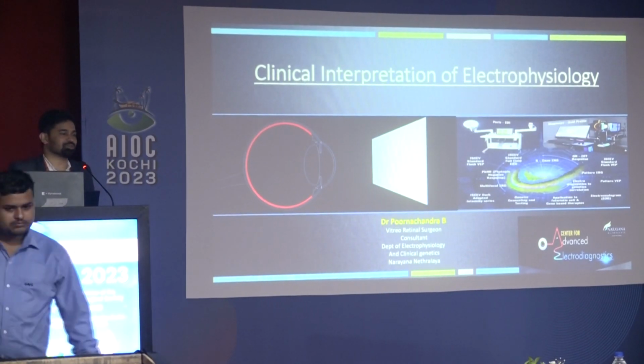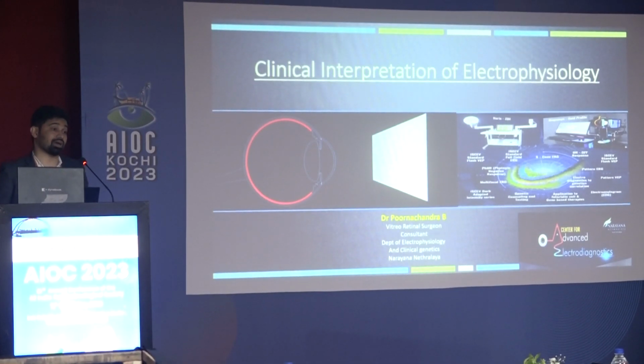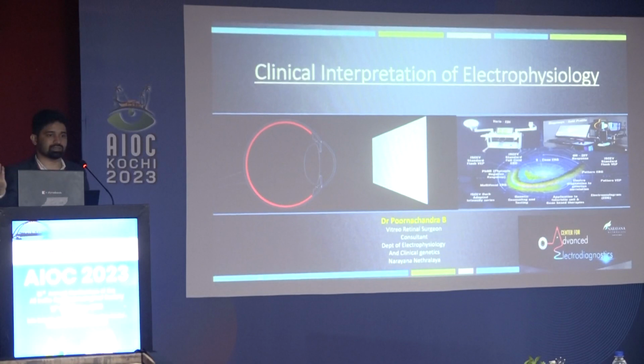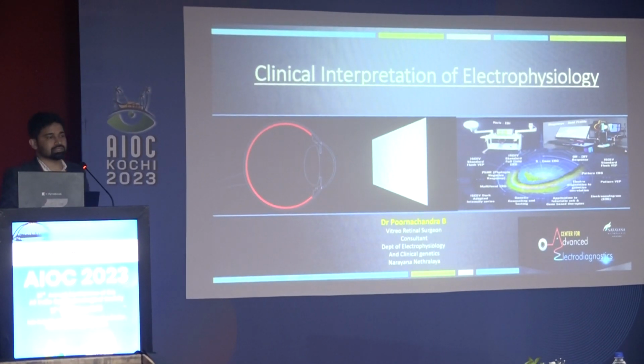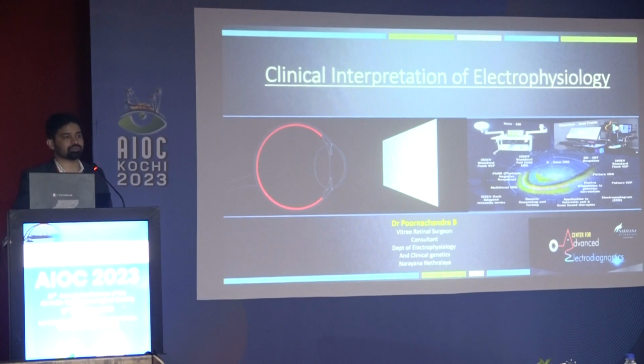This is something which used to run away, because somehow we are not comfortable looking at the waveforms. We feel confused, and we always assume that this is a recent advance, that I will read it late, before the exam. But this is not something which comes under recent advances. This technology has been there for a very long time. Some of you are going to become specialists in various things, cornea, glaucoma, retina. Irrespective of the specialty you practice, ERG is something which everyone should know.